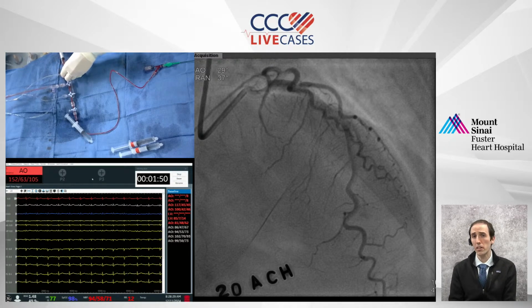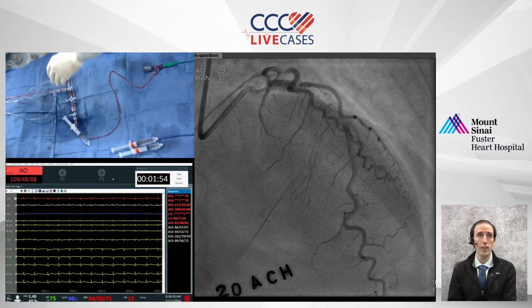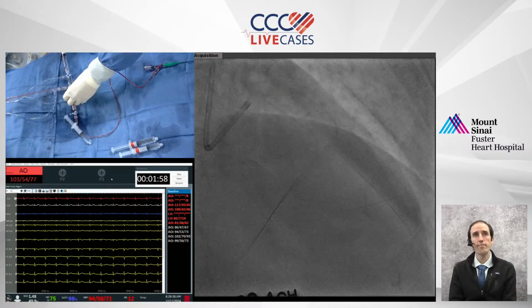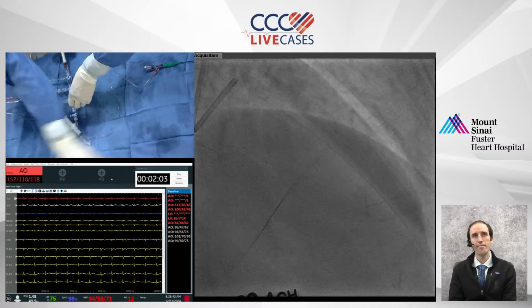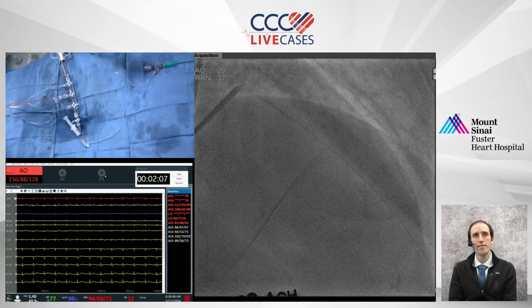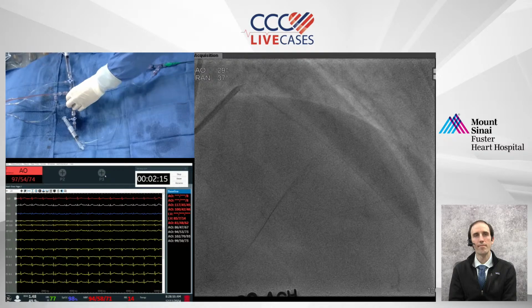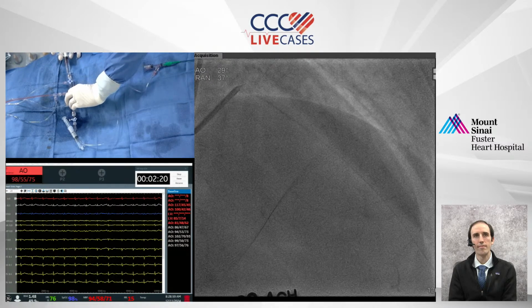I think the symptoms are particularly challenging because you've given this patient sedation. I'm assuming this patient got fentanyl and Versed? Correct, and that's one of the aspects I was going to say, that the patient is lying flat on a bed under an immense amount of sedation. So whether the symptoms are going to be there or not. I also feel, and I don't know how you feel about this, that if I push to 200, let's take this picture. Go ahead and check your EKG. Yeah. So I did that over a minute and 20 seconds.